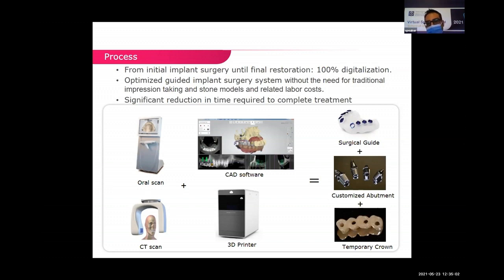In this digital impression, we have all the superficial tissues in the oral cavity, such as tooth crowns and the surface of the mucosa and gingiva. The second digital image is the CBCT, and it includes the inferior parts like bone, roots, nerve, and sinus. So we have some common points in these two digital images.